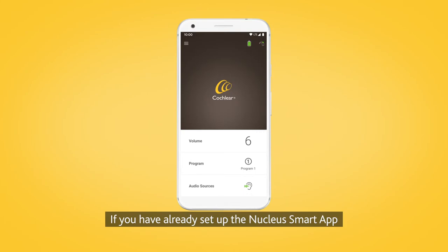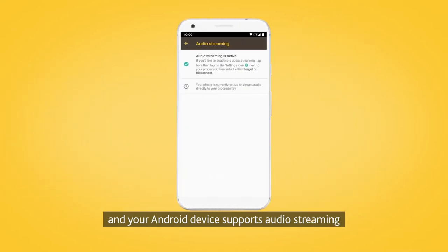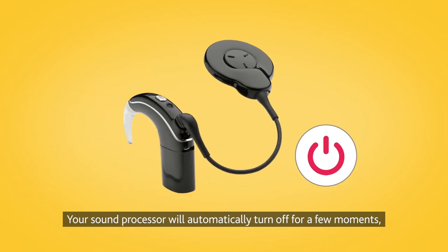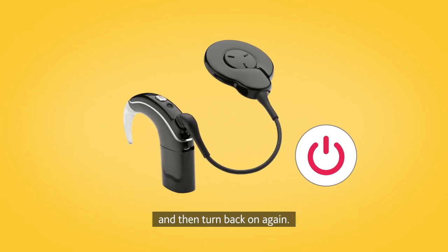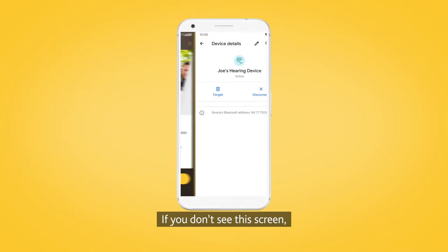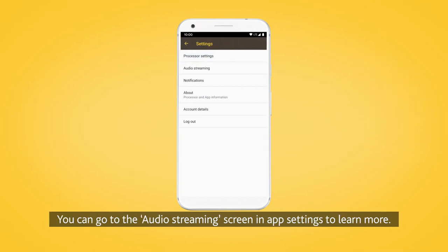If you have already set up the Nucleus Smart App and your Nucleus 7 sound processor, and your Android device supports audio streaming and displays the audio streaming screen, tap Enable. Your sound processor will automatically turn off for a few moments and then turn back on again. If you don't see this screen, it may be because streaming is already enabled on your device. You can go to the audio streaming screen in app settings to learn more.